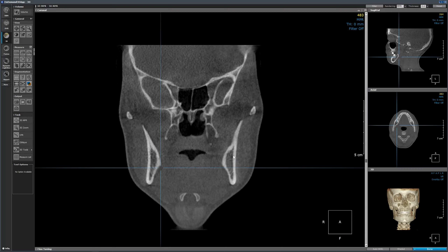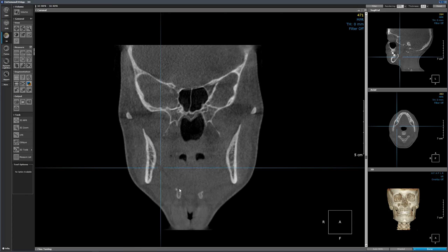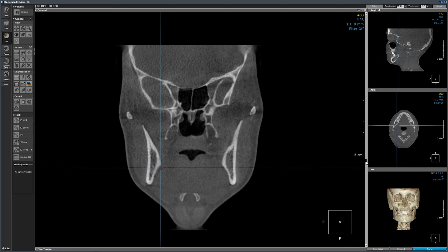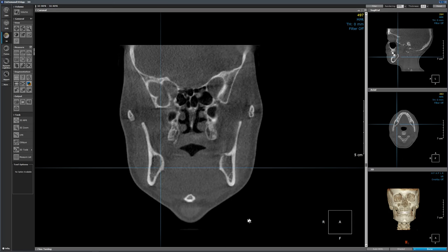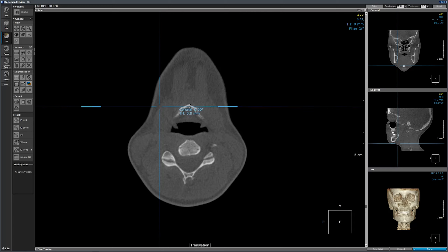Now we are in the region of the mandibular ramus. This would be the coronoid process. Going further distally, we picked up one more structure — this is the hyoid bone. Because this is a slice, we are not seeing the whole curved structure. Moving anteriorly, you can see the continuity of the hyoid bone. Using the crosshair, you can see the hyoid bone on the axial view as well.